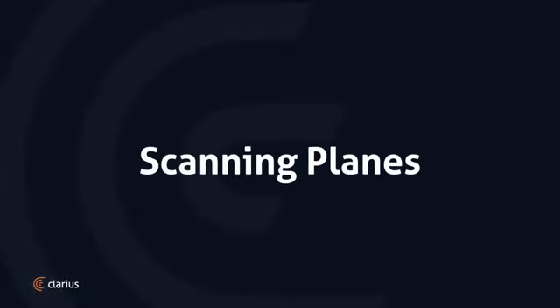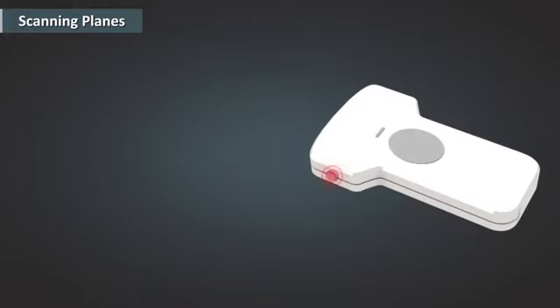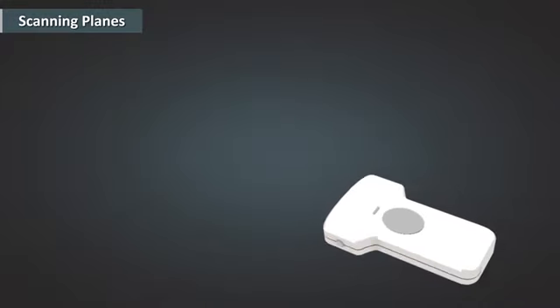Let's move on and talk about scanning planes. Before we discuss the four scanning planes, let's go over transducer orientation. Most transducers have a small bump, mark, or indicator at one end of the transducer. This indicator corresponds to the first element of the transducer and will have a matching indication marker on the left side of the ultrasound image.